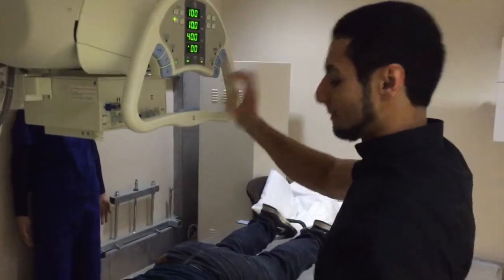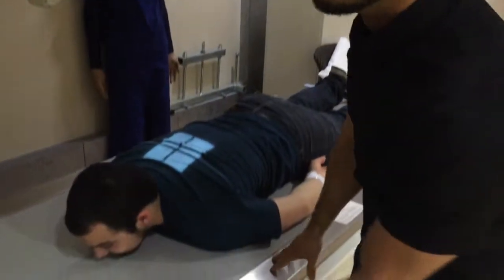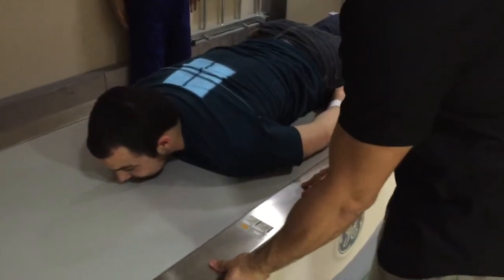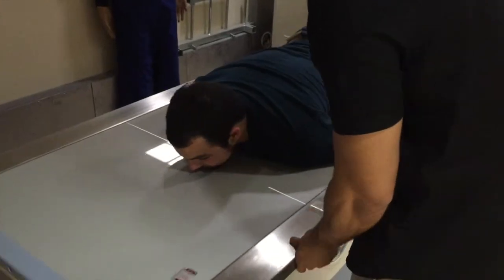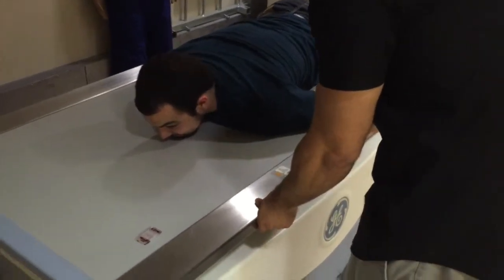38, oh, that's good. Next, we want to align the patient to the tube. And that's right there. He was moving me around a lot. I got really dizzy.